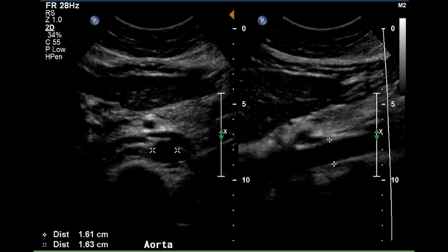This is an ultrasound duplex examination to rule out renal artery stenosis. Doppler was also used to assess both renal veins and the vena cava.